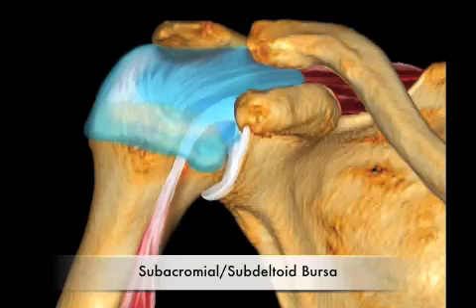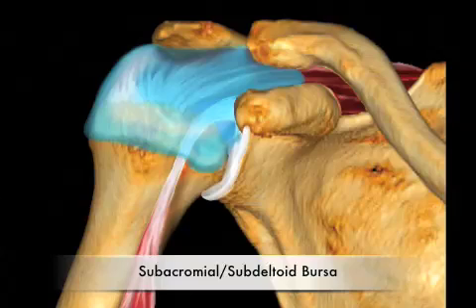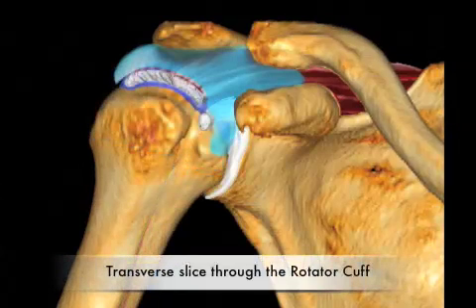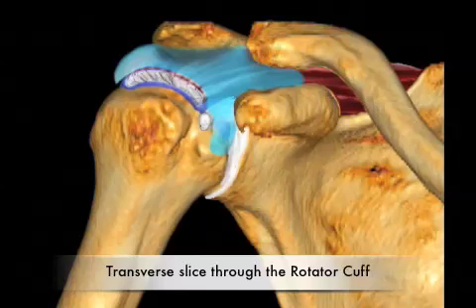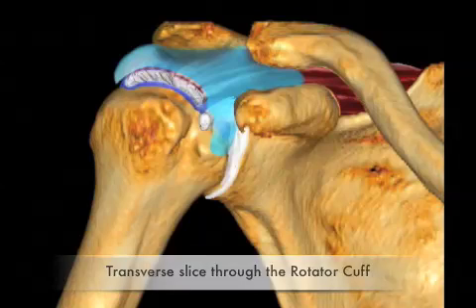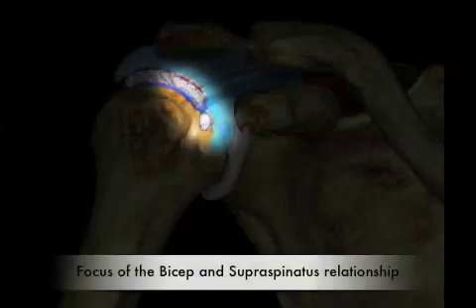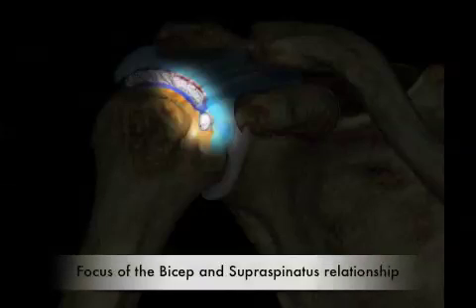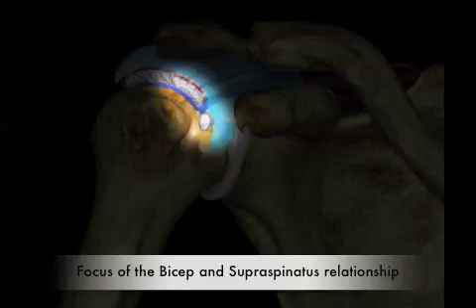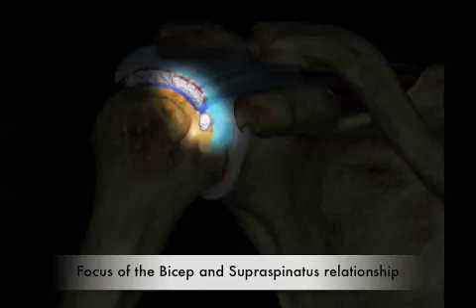Enveloping the bulk of the rotator cuff is the subacromial/subdeltoid bursa as seen here. This illustration represents a transverse slice through the anatomy of the supraspinatus and infraspinatus. The main emphasis of this video will be to describe the relationship of the supraspinatus and biceps tendon at the level of the rotator interval.